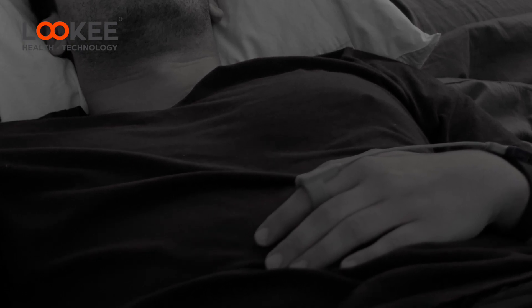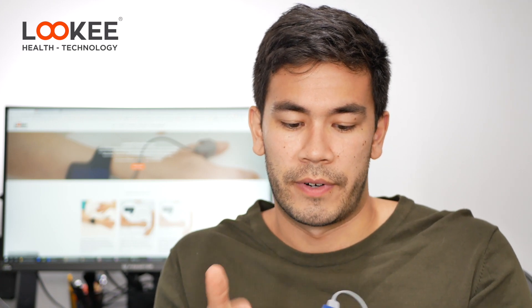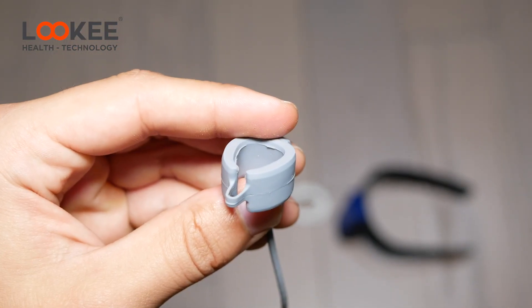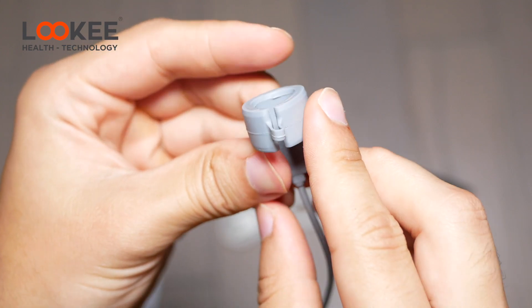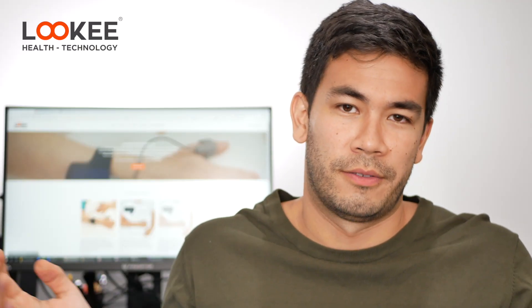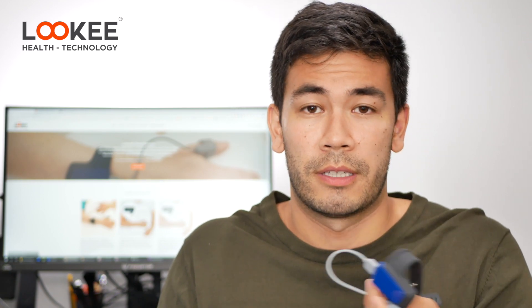It's a lot more comfortable than a smartwatch because the base where the battery is is very light. In terms of hardware and fit, this accommodates all types of finger sizes. Whether you have a petite or large finger, it will fit because it has a very expandable rubber band, which makes this product very accessible to everybody.